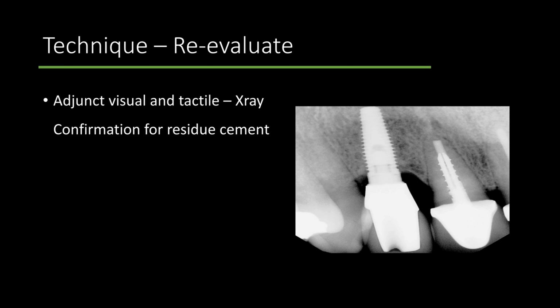Under special circumstances where minimal excess is even more critical, such as after surgery, on immediate loading, or with unavoidably deep margins, modify the technique. In addition to removing external excess, remove internal cement 1.5 to 2 mm above the crown margins. Then, reseat the crown as previously described. This will help ensure minimal to no cement excess for an undisturbed implant and soft tissue healing.